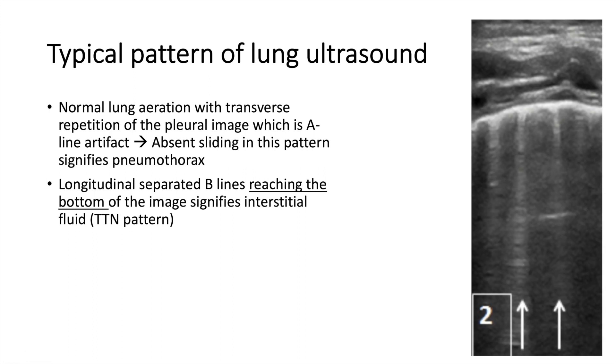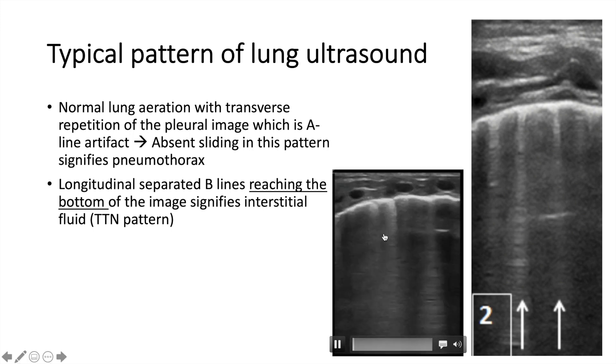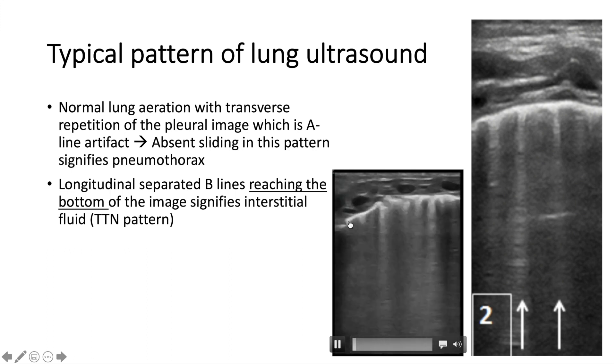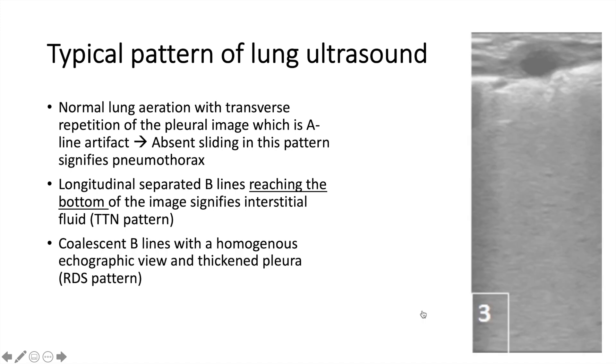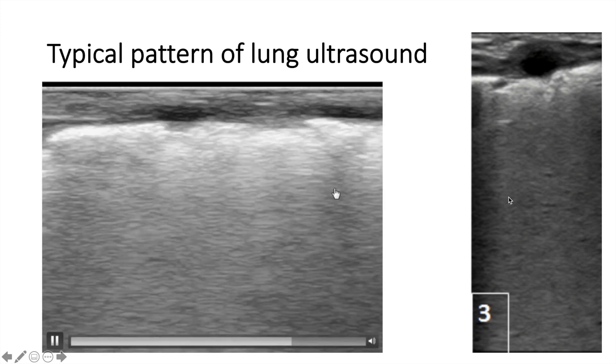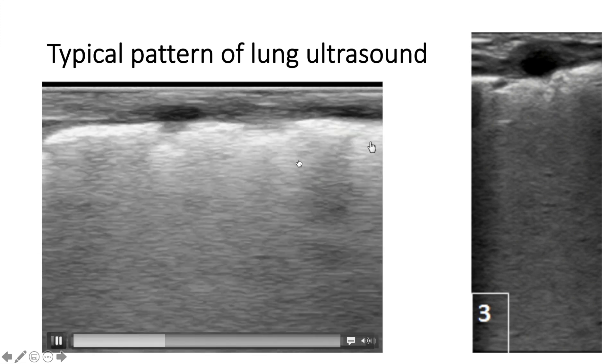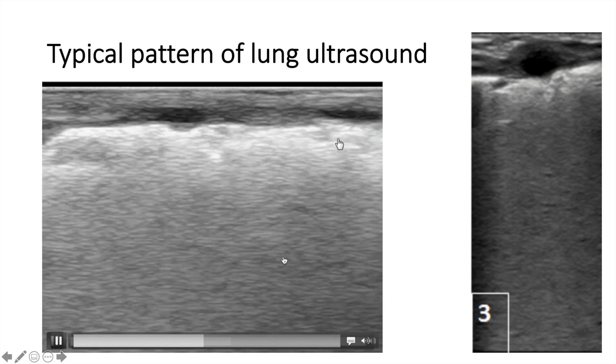The second pattern is the wet lung. This vertical line here extends all the way to the bottom — this is what we call the B line. You see a few of them; this means wet lungs, and you see not a lot of A lines. This is consistent with TTN. You see sliding pleura, no pneumothorax, and the B lines. Sometimes if it's severe enough, they fuse with each other. You see sliding pleura but no A lines, and lots of fused B lines.